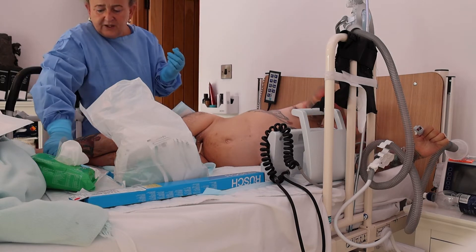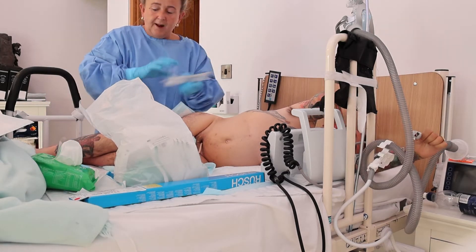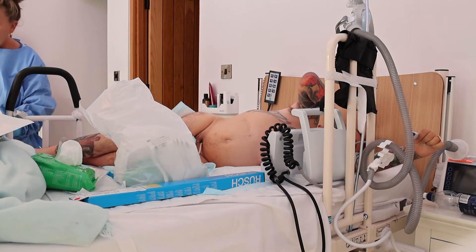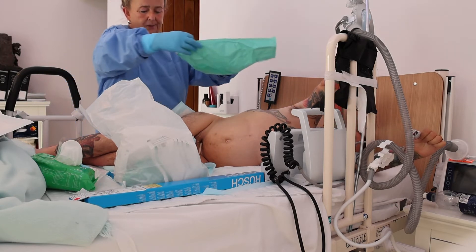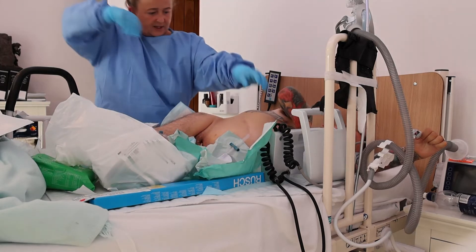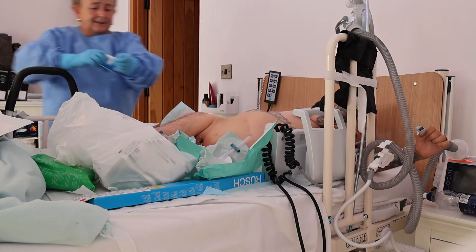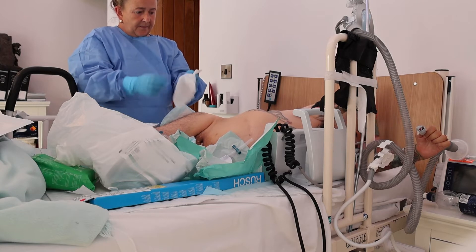I've got rescue meds. First things first — we've deflated the balloon. Get your instillagel ready. I can't touch the inside of the packet because it's going inside the stoma. It's one-handed and anyone can do this. I bring it upside down — my whole sterilized path towards me. I continue throughout to wipe my hands with a clinical wipe even though I'm going to double-glove in a minute to check this.